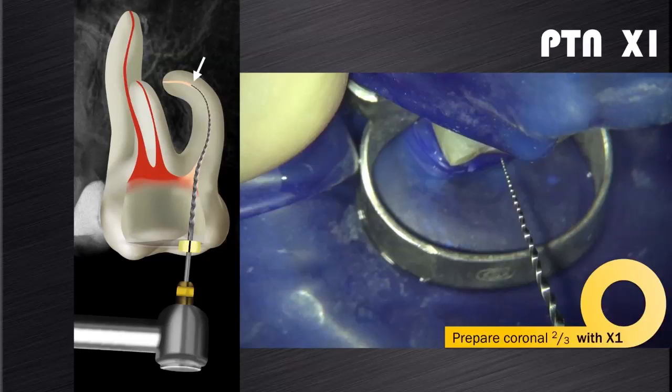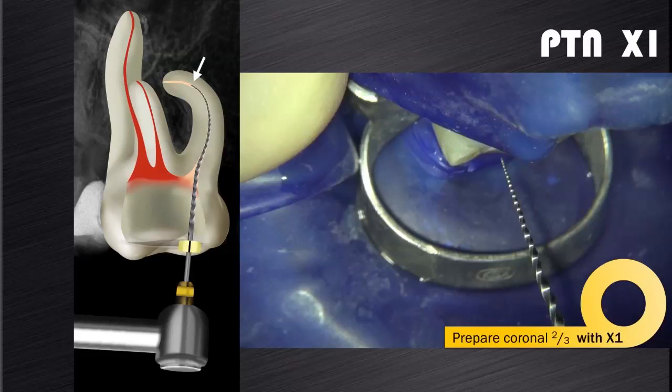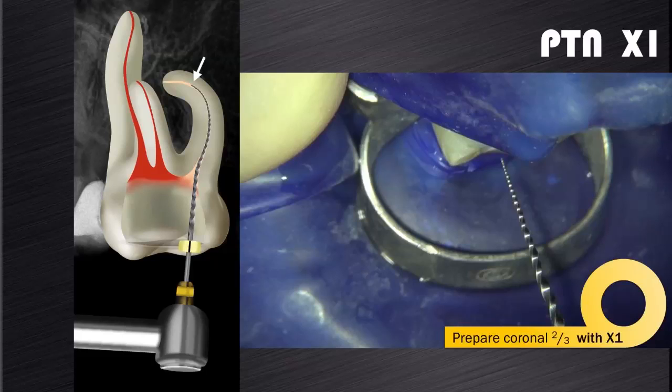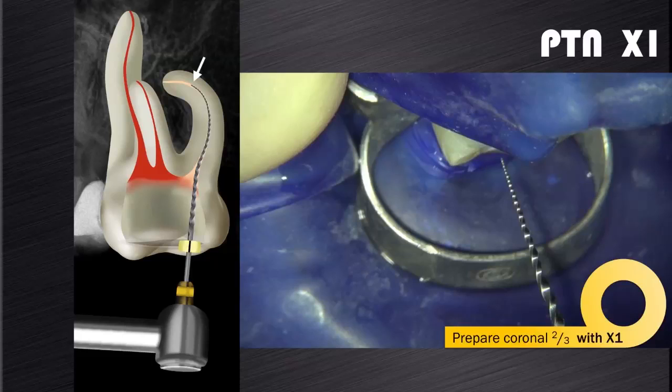After irrigation, recapitulation, and re-irrigation cycle, it is time to introduce the ProTaper Next X1 file into this challenging anatomy of this canal.